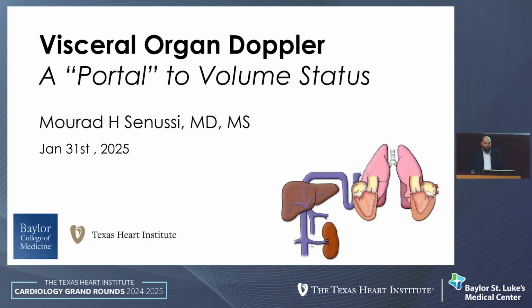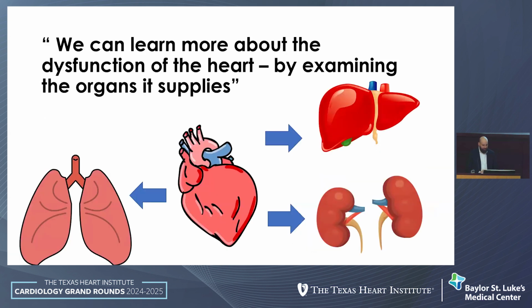So, today we're going to be talking about a topic that's very near and dear to my heart. And we'll be talking about visceral organ Doppler. And if you're not familiar with it, don't despair. This is not a very common topic. This is actually a novel technique that's being used to assess volume status.